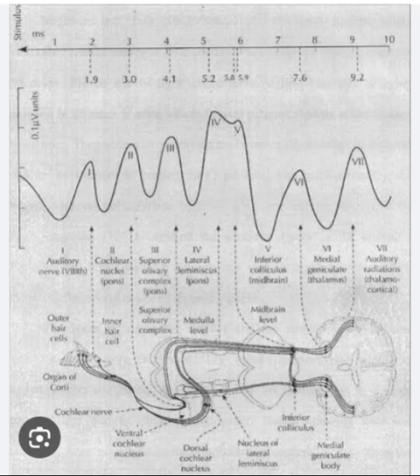Morphology. The shape of the waveform. This can have significant variation from subject to subject and differences in the same subject due to differences in stimulus type, frequency, and intensity. Amplitude. The strength or magnitude of the waveform. It reflects the number of neurons firing synchronously in response to the stimulus. Larger amplitudes generally indicate a healthier and more robust auditory system.